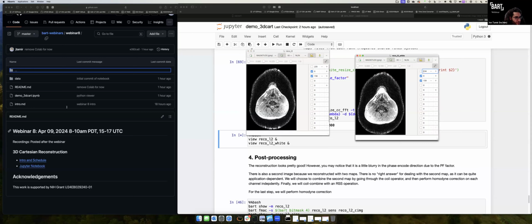Okay, another question. Since the readout is not fully sampled, I always use 3D recon directly rather than do IFFT first on KX, but it costs a long time. Is the parallel calculation available for this case? So this is 3D cardiac cine. Okay, so the question is, if you do homodyne in the readout direction, can you still do slice by slice reconstruction? I actually don't have experience doing that. Anyone here care to chime in?